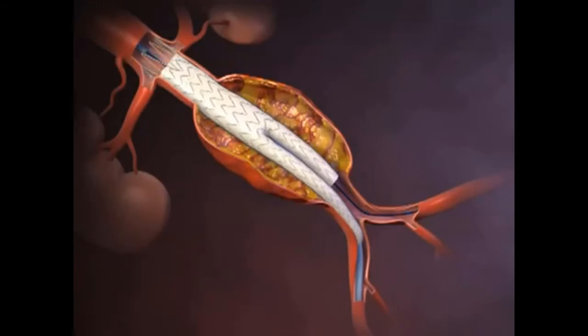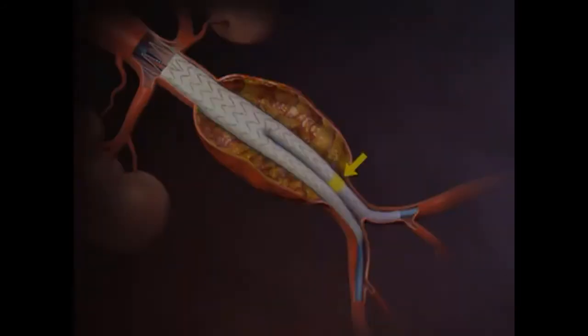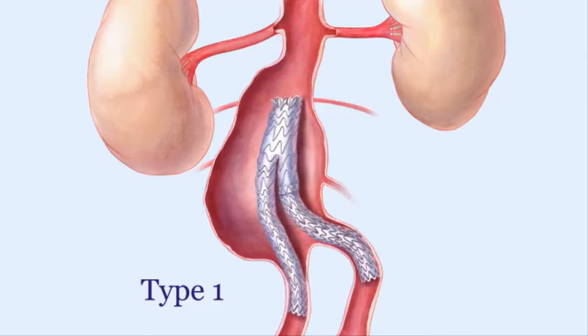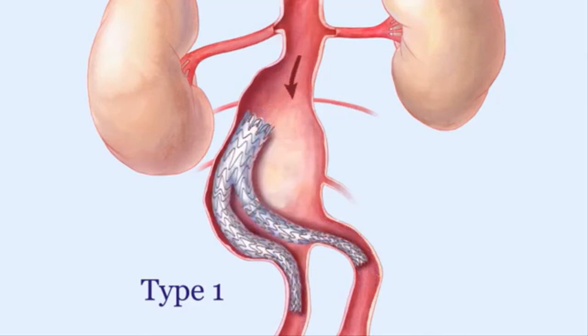The stent graft is fixated to the aortic vessel walls using hooks, which you can see in this video. And this is only possible if the patient's aorta has a healthy neck. In a significant number of patients, type 1 endoleaks are happening. Hence, the blood flow doesn't go through the stent graft, but the gap between the stent graft and the aortic vessel wall allows the blood to enter the area of the aortic aneurysm, further weakens the tissue and pressurizes this volume, and this can lead eventually to rupture.